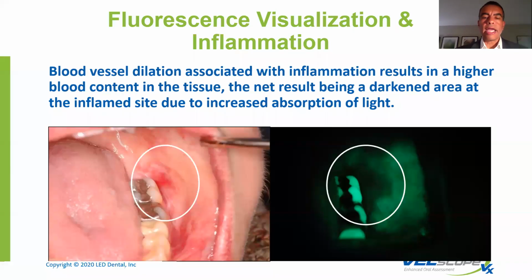So this technique is going to resolve 98% of all the abnormalities you see. And once you see it, you're going to begin to notice a difference. These tend to be more grayish in color, sometimes maroonish in color too, when it comes to an inflamed, irritated area. Critical important point though, we have to have a basement membrane to blanch across, right?